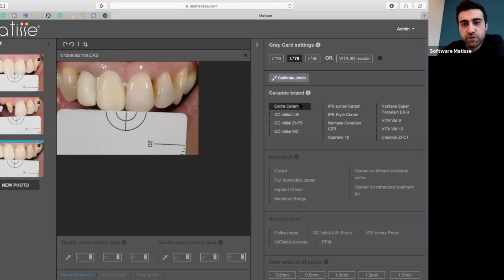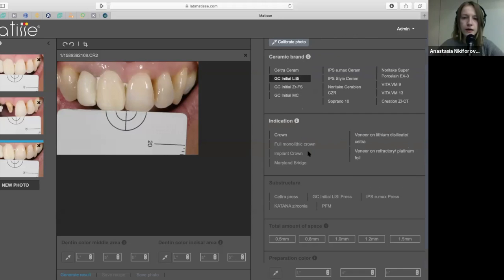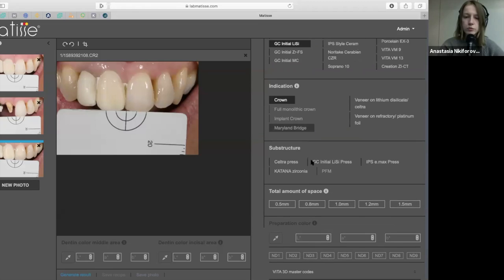So let's choose our ceramic brands. Which one do you want to see now? Let's start with GC Lisi. We have indications here: crown, veneer on lithium disilicate, veneer on refractory. These three will be soon available. In this case we choose crown.